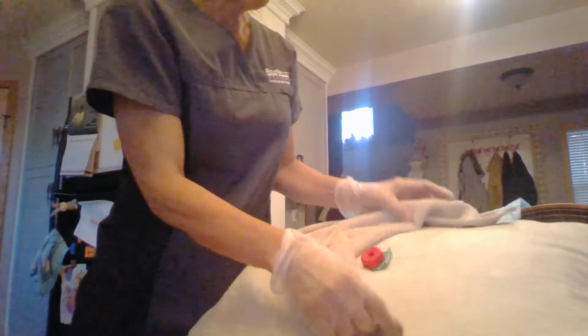So now we've removed the system. We have placed the pouch in a pan. We have covered it to mask the odors, and we might want to change our gloves, putting them in the proper disposable waste basket. Clean and sanitize your hands.